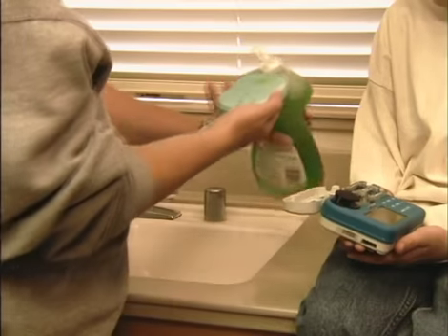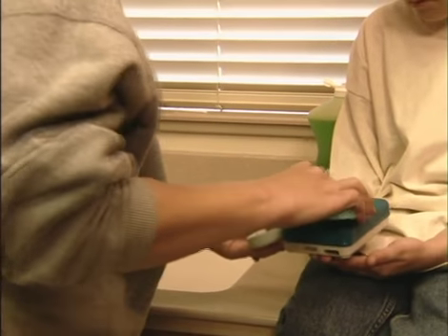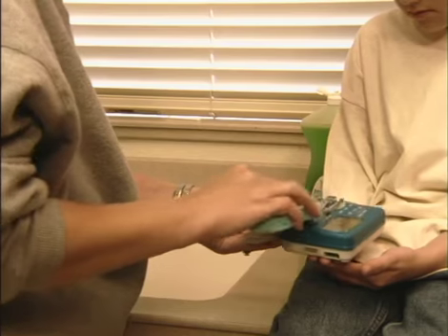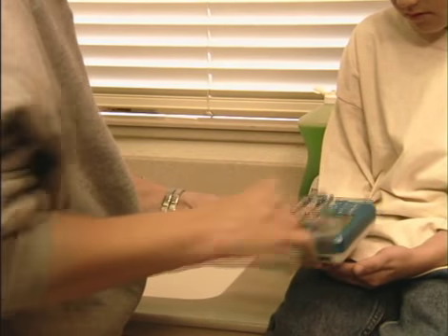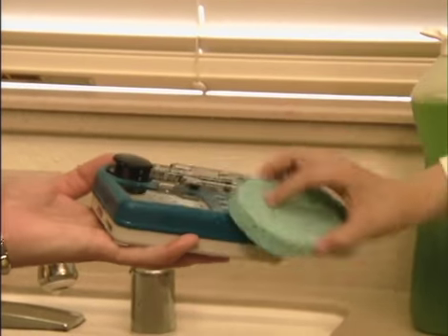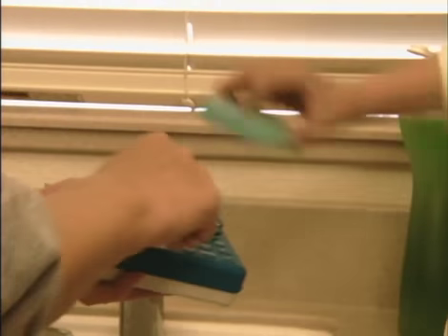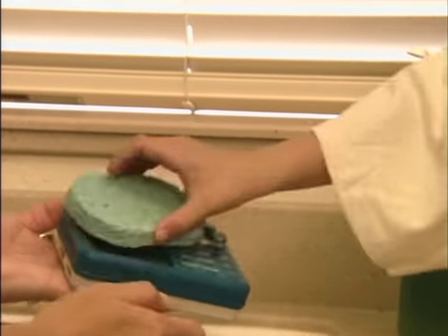The EnteraLite Infinity is really easy to clean, even fun to clean, if you're 6 years old. To clean the pump, first unplug the adapter from the pump and the wall to avoid receiving an electrical shock. The pump can be cleaned with warm soapy water and a non-abrasive sponge or cloth. Also, a 5% bleach and water solution or a multi-purpose disinfectant cleaner may be applied for about 10 minutes.